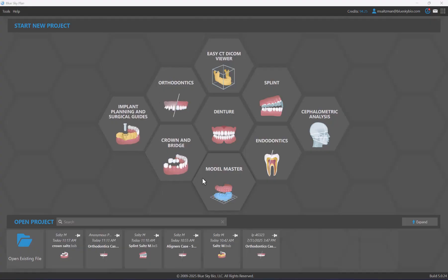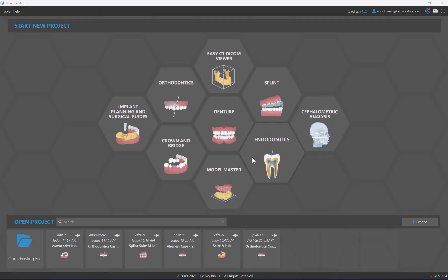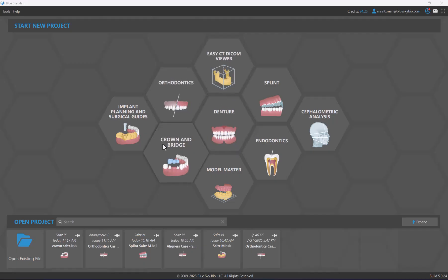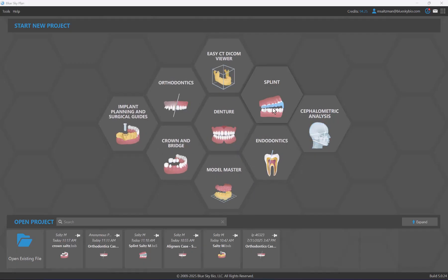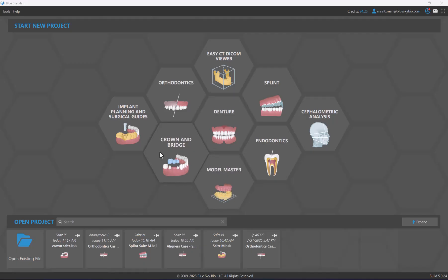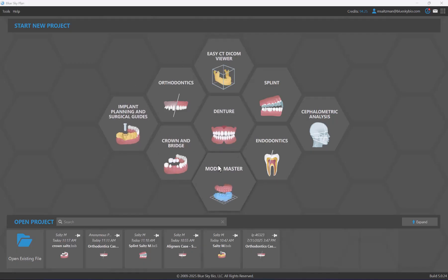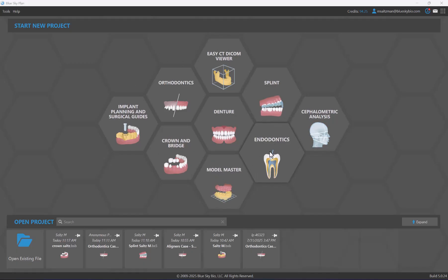The new Blue Sky Plan now contains new introductory screens that allow you to start projects, open projects, and organize your projects faster and easier than ever before. In this tutorial video, I will review the features, functionalities, and capabilities of these introductory screens.